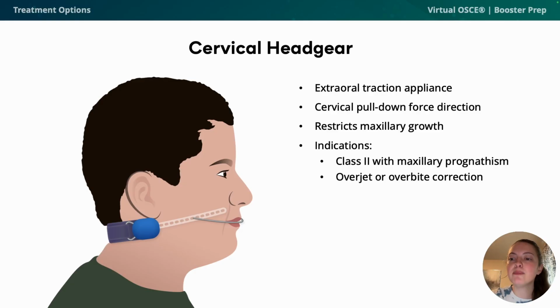Now, what is very important about this treatment option being cervical headgear versus the other type of headgear we'll go over soon is the vertical component. This strap is pulling back, but also down on those maxillary molars, meaning they will experience extrusion. This will open up the patient's bite and is therefore best for patients with a low facial height pattern.